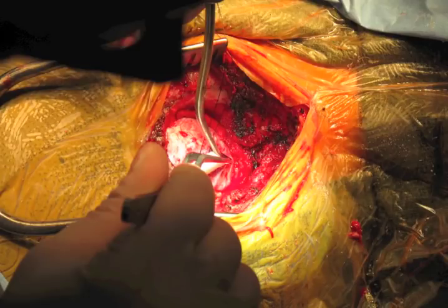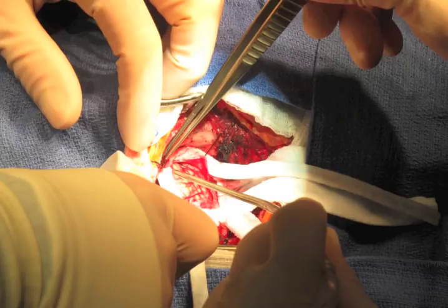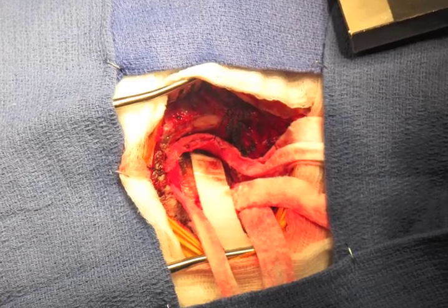The cisterna magna may be opened to drain CSF and provide brain relaxation. The dural opening is then extended superiorly and teed off towards the transverse sigmoid junction. The dural flaps are reflected using 4-0 silk sutures. Wet sponges and towels are placed at the edges of the surgical domain and the Greenberg retractor system is assembled. The exposed cerebellum may be covered with SurgiCell and Telfa for protection.